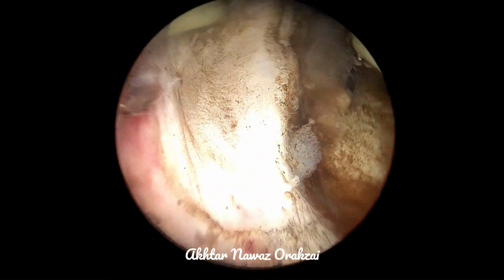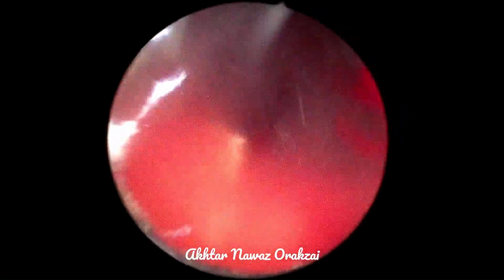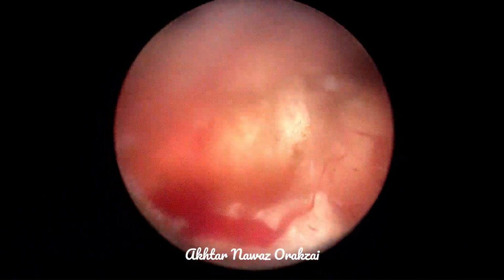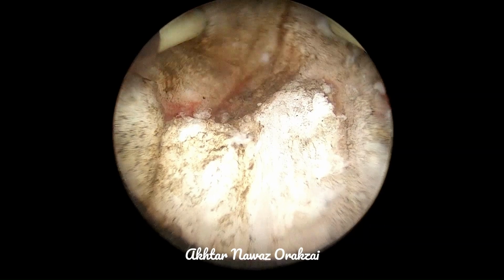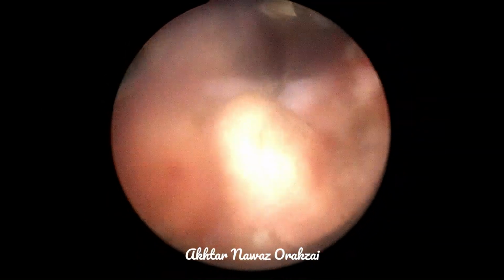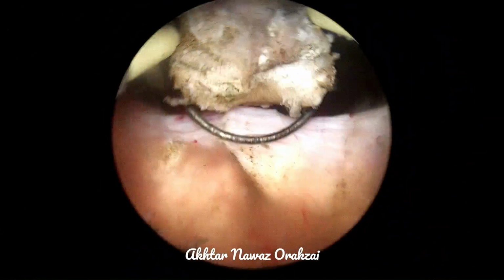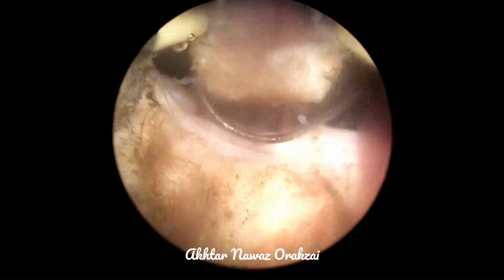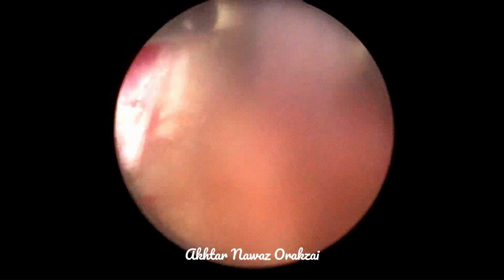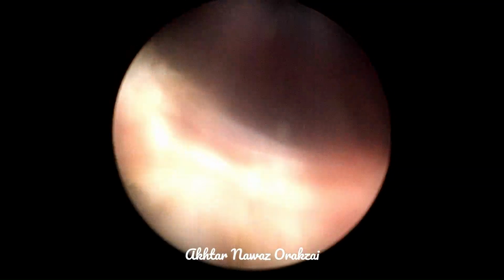So we will perform a minimal resection here, trying to stay away from the capsule as much as possible, number one. As we know, the nerves for the erectile function are running along the posterior lateral aspect of the prostate, just outside the capsule. So by staying away from the capsule with the diathermy, be that cutting or especially the coagulation mode, we can preserve the erectile function of the patient, number one.